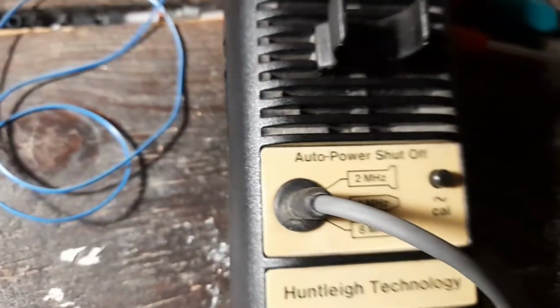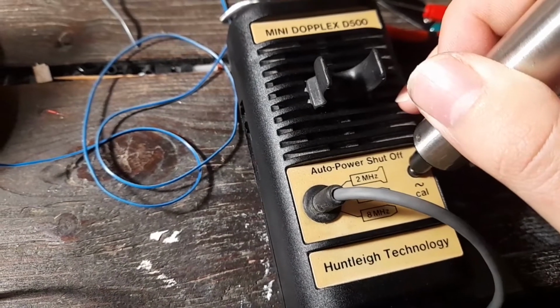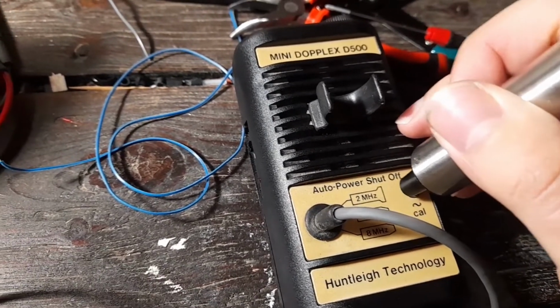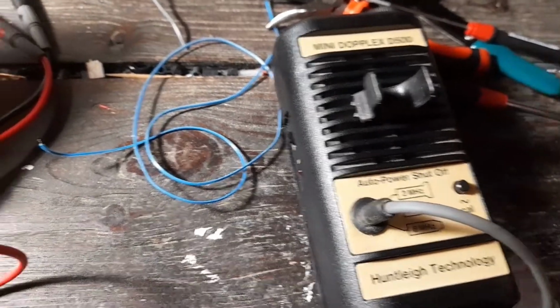Let's see if it works. It seems to work. We're gonna soon find out. It's a bit annoying.